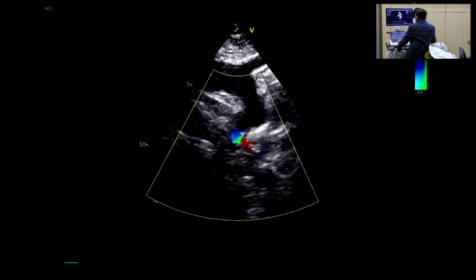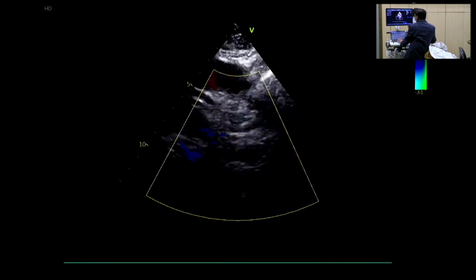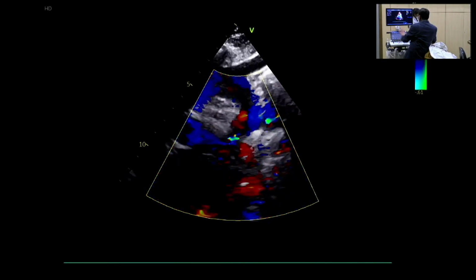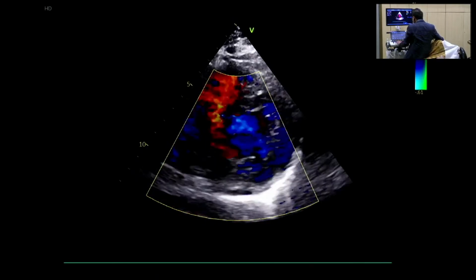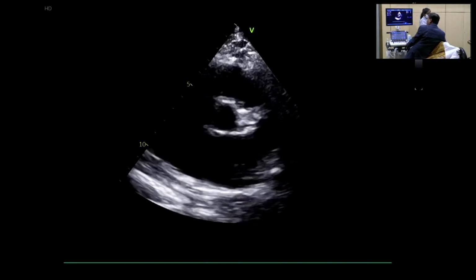So this is a simple coarct, and no VSD, no parachute complex, yet to see bicuspid or tricuspid aortic valve. Rest all is okay, no PDA also. All agreeing with me? Even if it's a bicuspid aortic valve, it's not going to make any difference. Just for the diagnosis, otherwise we are not going to do anything for this.